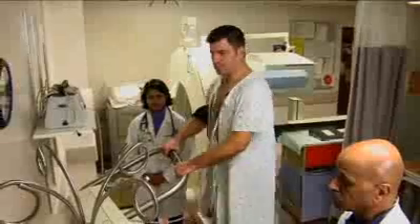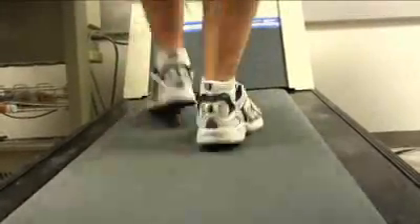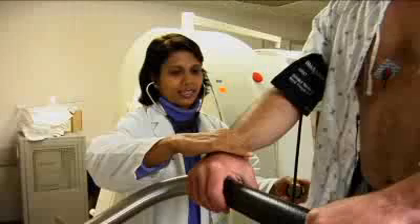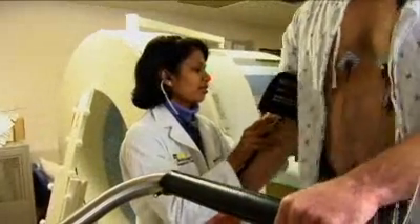You will then walk on a treadmill machine, which is an electrical walkway that can be raised. The speed and incline will increase gradually, such that you will be walking uphill. Your blood pressure will be checked intermittently and from time to time you will be asked if you are experiencing any symptoms.